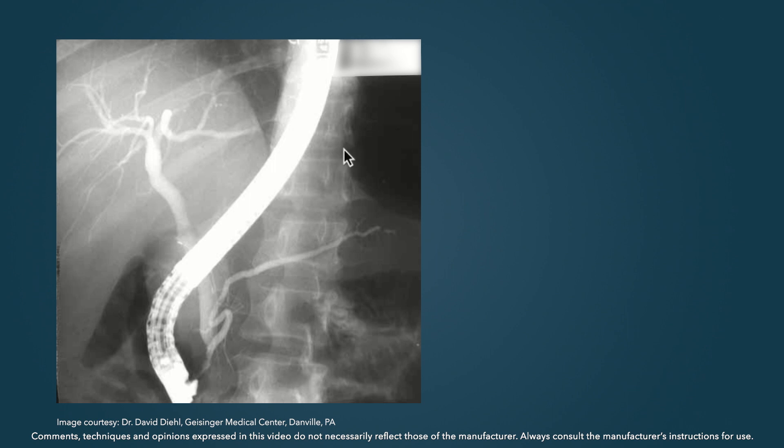This is a nice example of representative pancreatic biliary anatomy. In this case, you can see the duodenoscope, and as a frame of reference, you should know that the duodenoscope diameter is about 12 millimeters. This serves as an internal ruler by which you can measure the diameter of the other ducts.